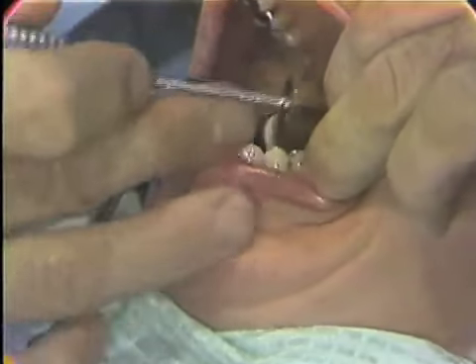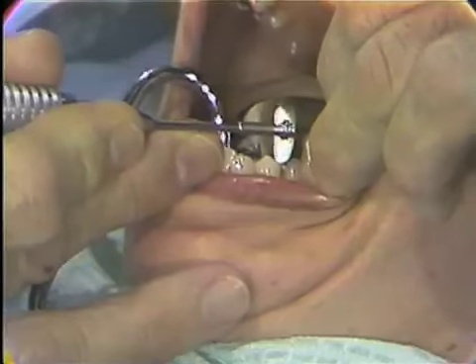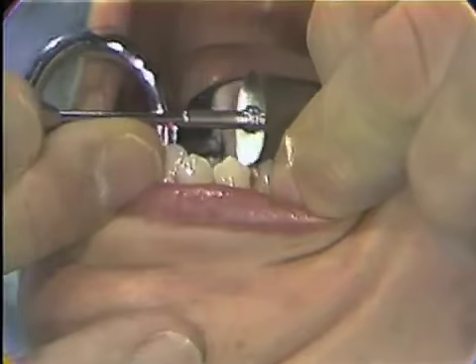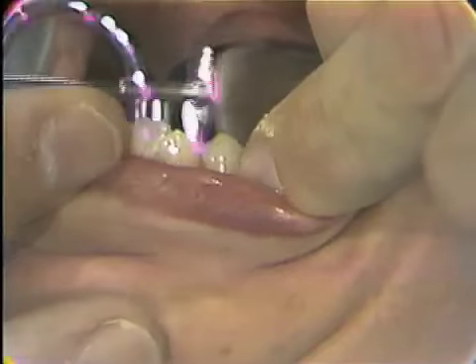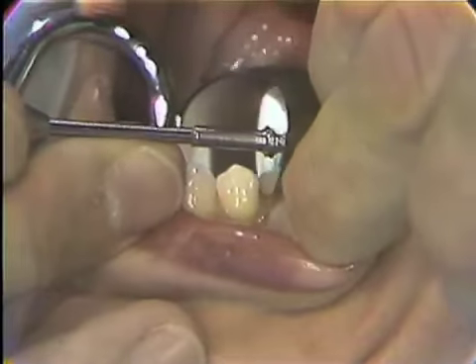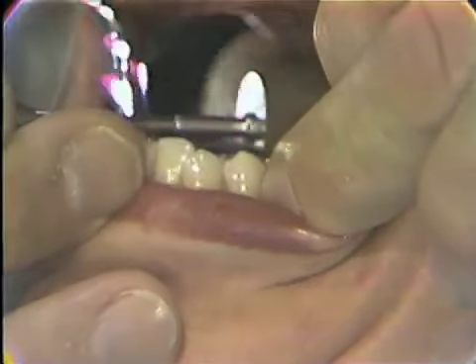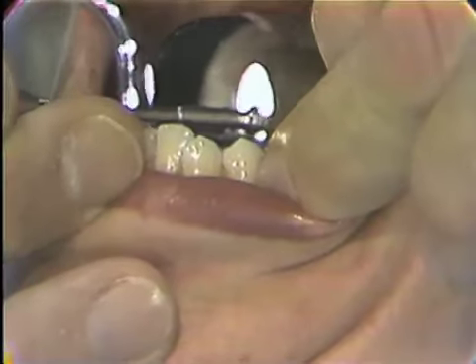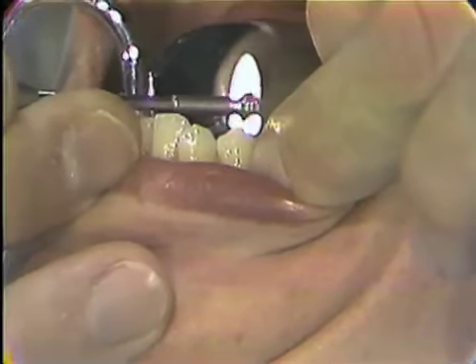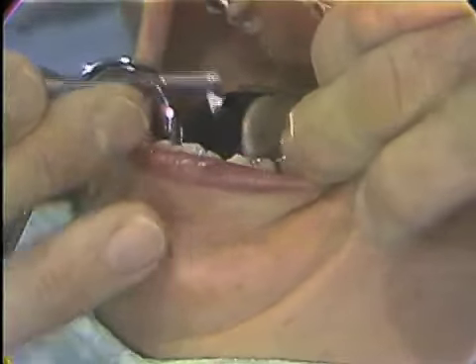Again, notice my hand, my fingers are holding the lip away from the preparation so that we can work in any of these positions and gaining our taper and the amount of tooth tissue that we wish to take. As we go to the buccal, we move our finger over like that and hold the lip away. We come to the lingual, the patient holds on, and we run the disc at a slow speed, very slow, and it will be a wiping action of this disc. We will demonstrate this a little more thoroughly on the typodont in a few moments.